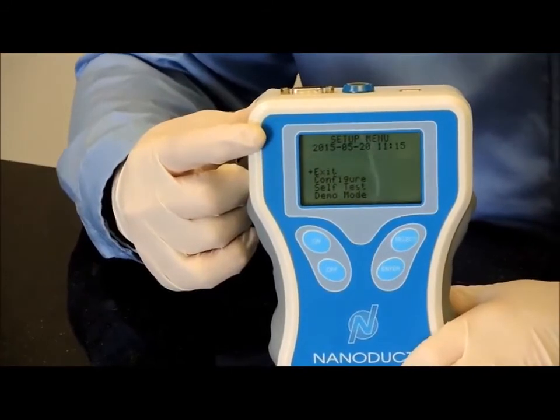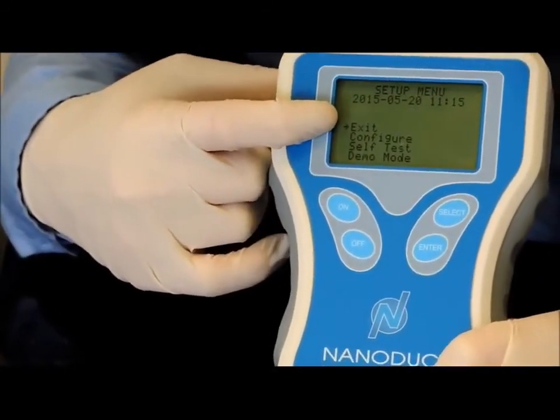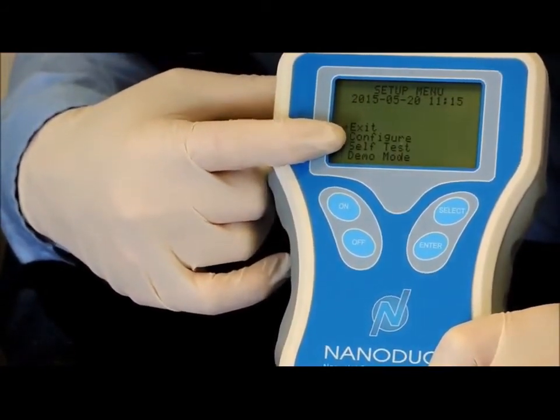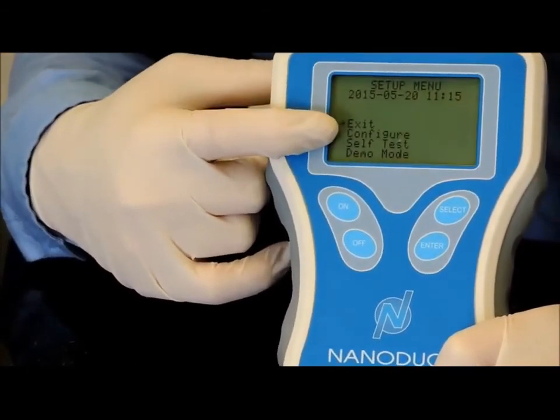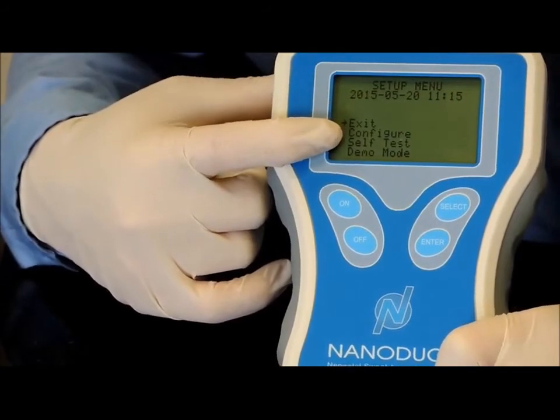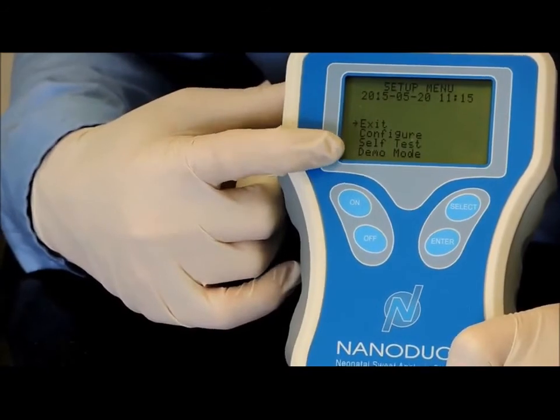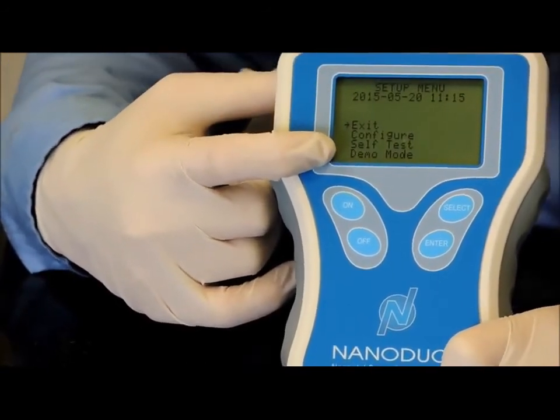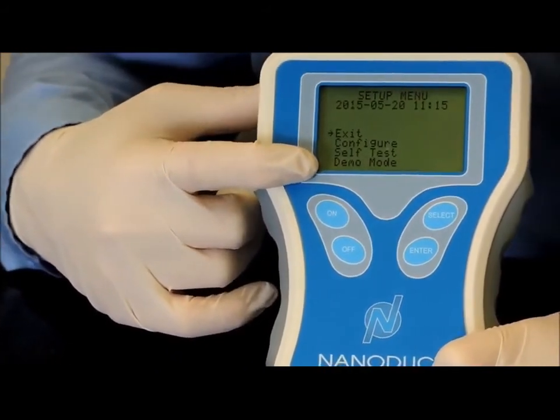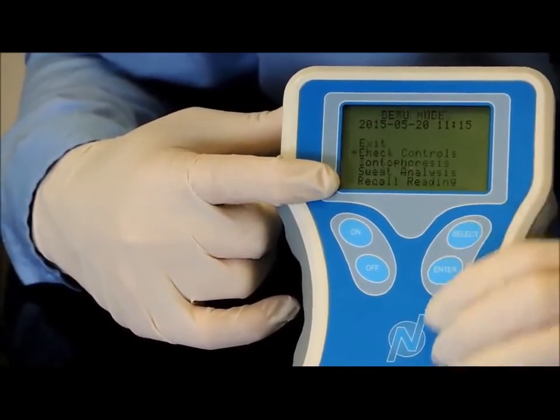So it's a different menu than we had before, and you'll see the arrow has some options: exit, configure, self-test, demo mode. Configure is where you can change the language. We have a few languages available. Self-test is described in the manual. We don't really use that too often, but the demo mode is a helpful tool, again, in demonstrating to potential customers or patients. So I'll select down to demo mode and press enter.